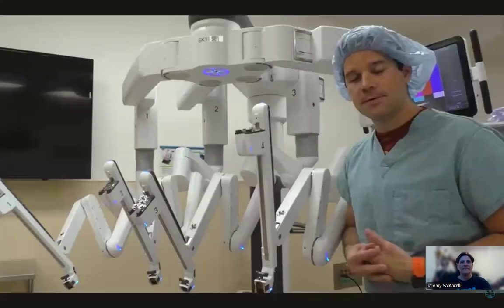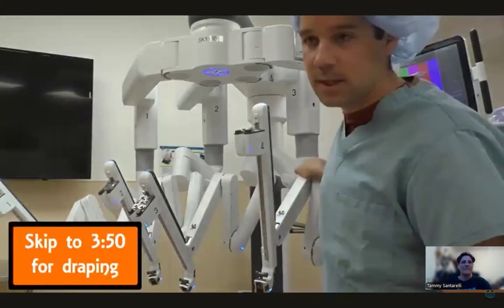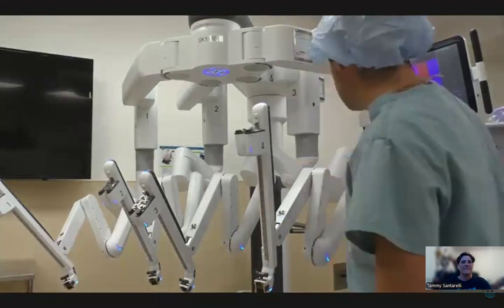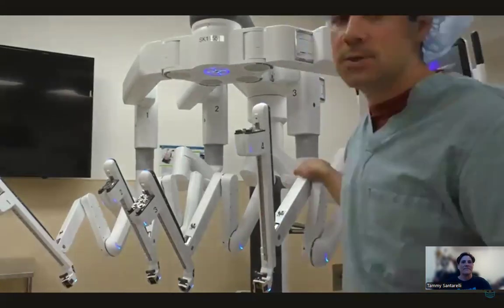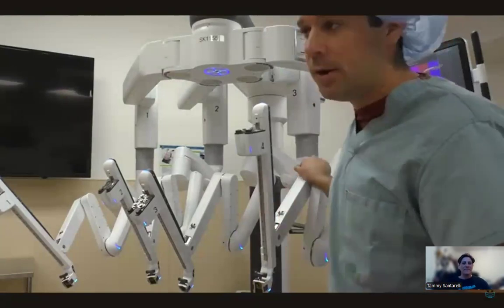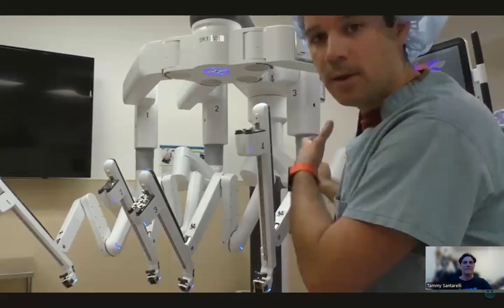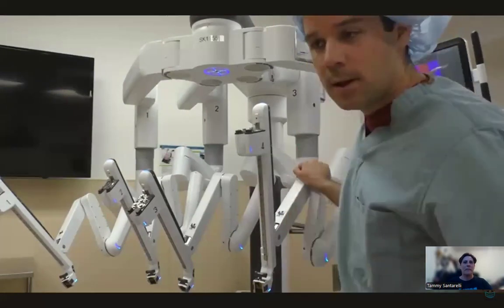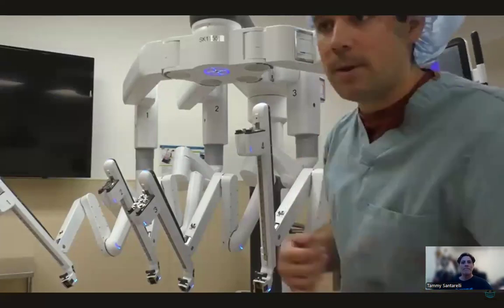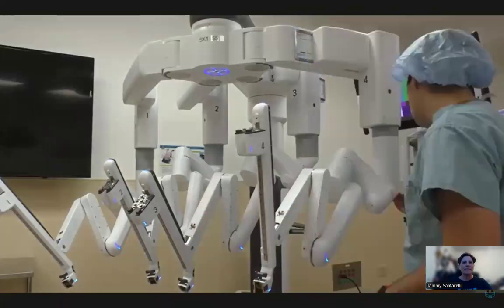All right, so first off, we're going to be talking about how to move these arms specifically, and also move the boom from the field. Sometimes when the nurse is driving the robot in over the patient, you need to move or rotate the boom. She or he can do it from the back of the console, but sometimes it's just easier for the people that are scrubbed in to just rotate the boom as the nurse is pushing it in, getting ready to dock it.